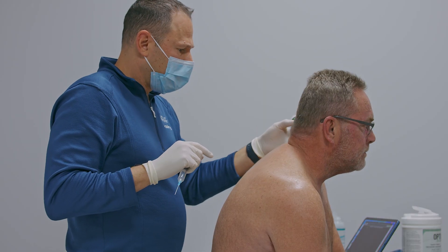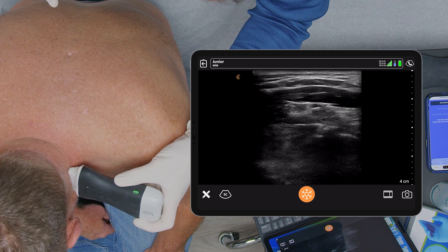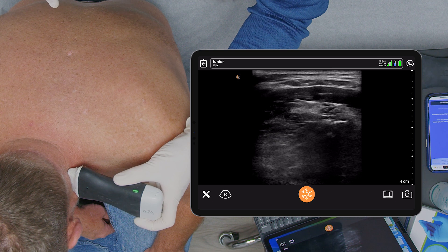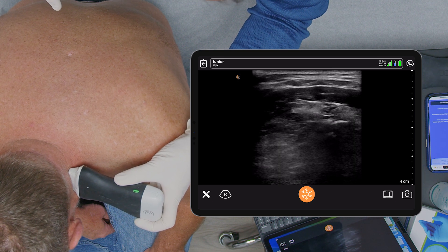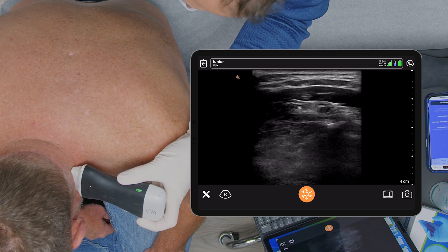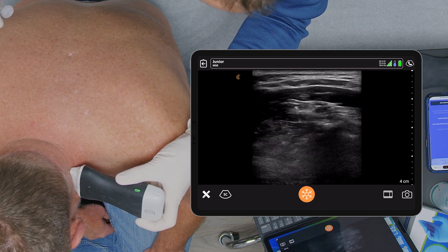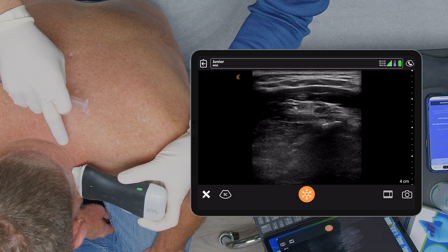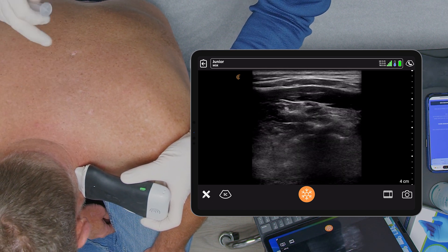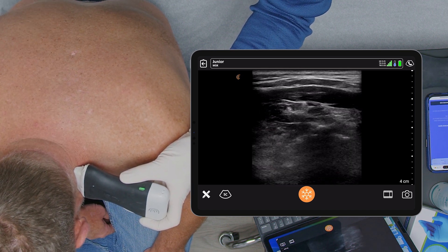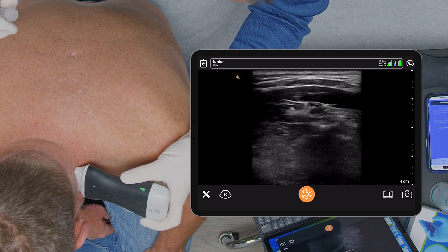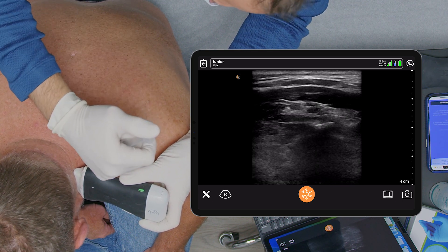We're going to look at the articular pillars now. We target the paravertebral space where the medial branch nerves pass. The patient confirms his pain originates at that point, and he has a crease in his neck there, which is typically where the most movement occurs — and that's where he's complaining of pain.